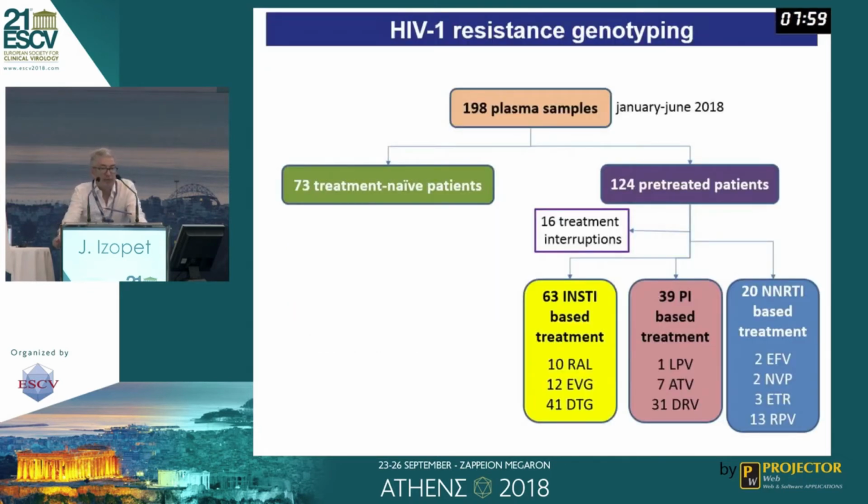In our prospective evaluation, we used 198 plasma samples. 73 patients were treatment-naive, and 124 patients were pre-treated.